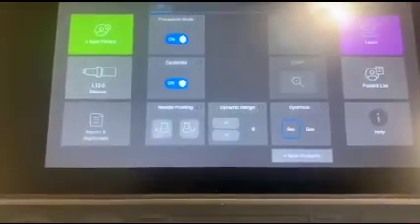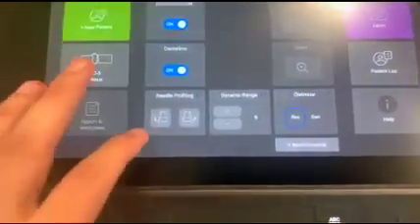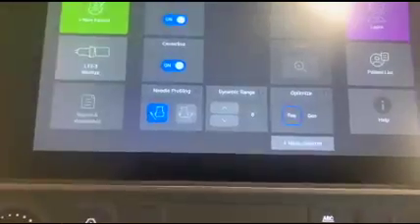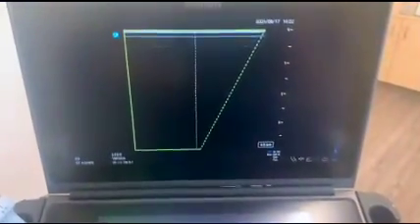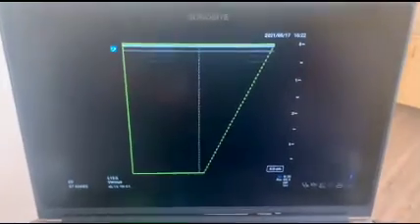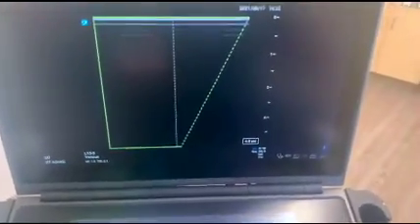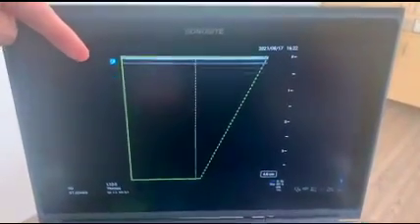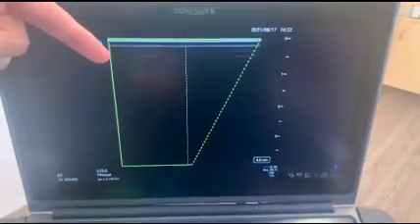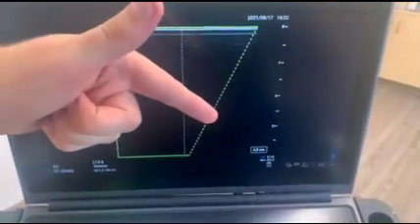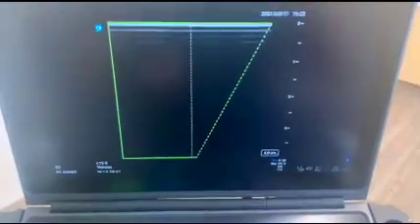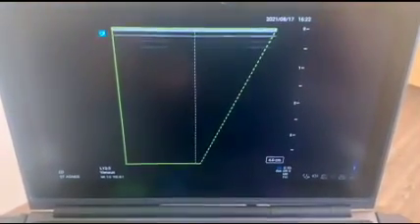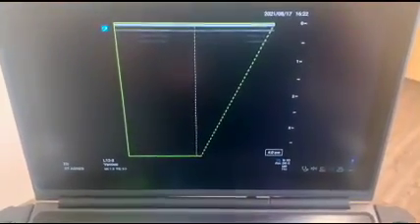Furthermore, there's also a needle profiling picture. Click this button, and a picture like this will pop up. If you are doing a block or a line, you can insert the needle perpendicular to this dotted line. If you do that like so, the needle will appear brighter and be more easy to see.